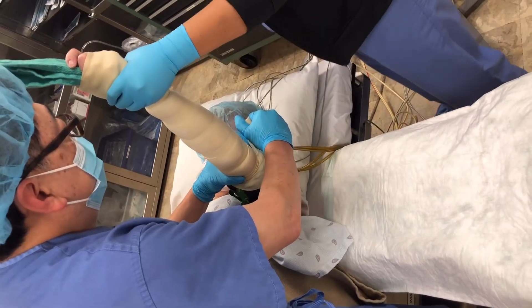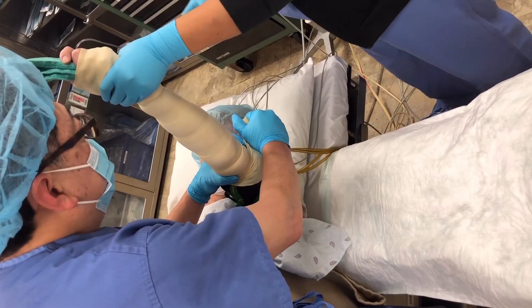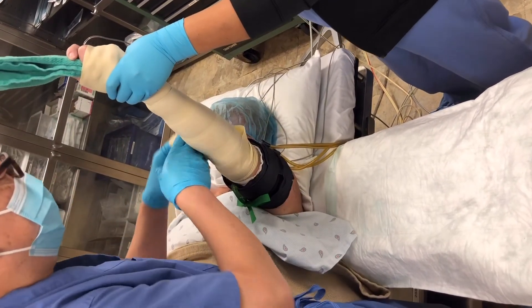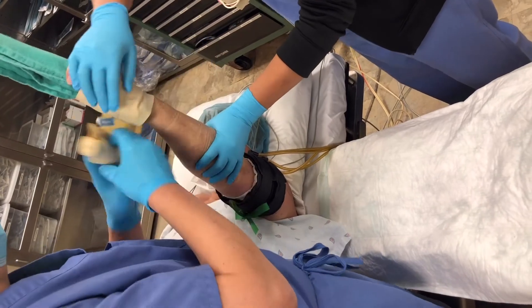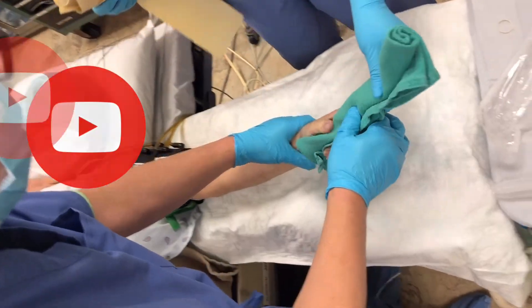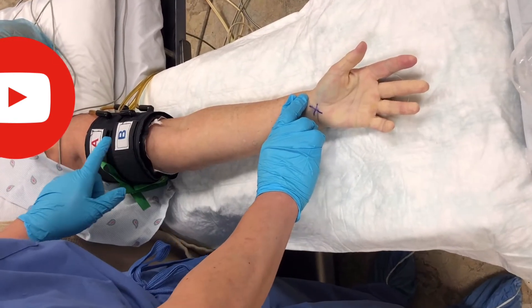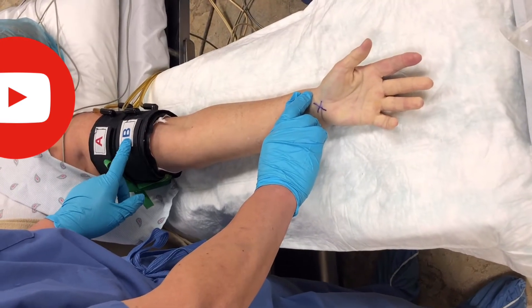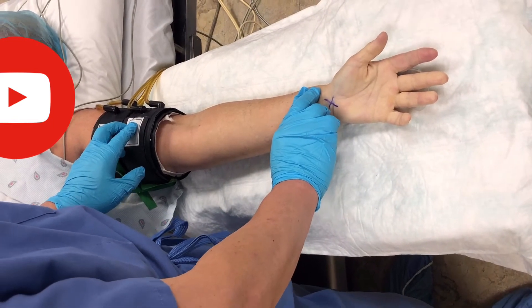Inflate the distal and then the proximal tourniquet. Then unwrap the Esmarch bandage. Now we test — feel the pulse. I don't feel the pulse, so it's good. Release the distal tourniquet. I still have no pulse. That's good.